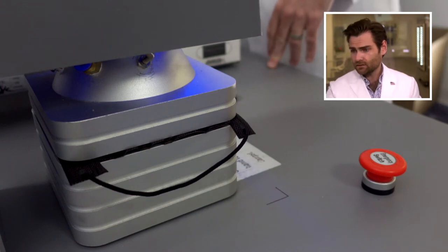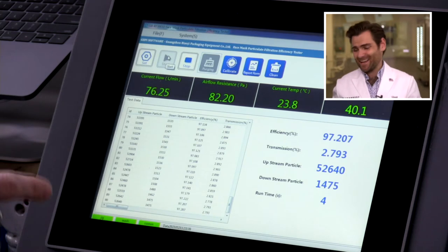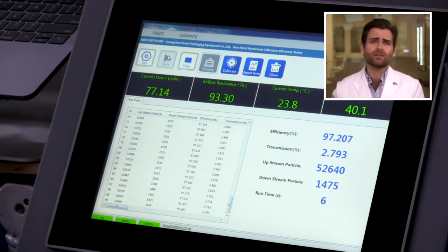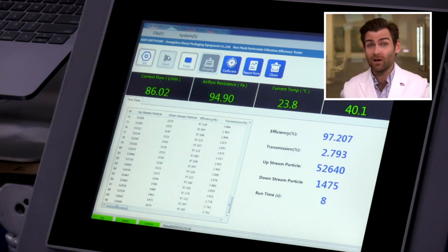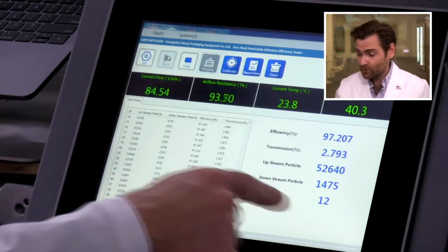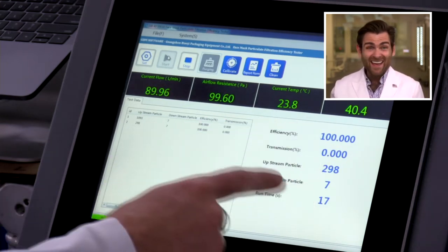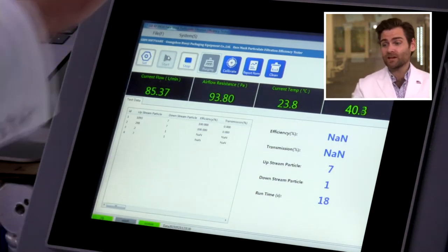This is a PFE machine — particulate filtration efficiency. If you want to find out more about what we're doing with all this crazy equipment, I'll put a link right below. This is going to reset in a second and then start running, and we'll see if this thing can actually protect you.